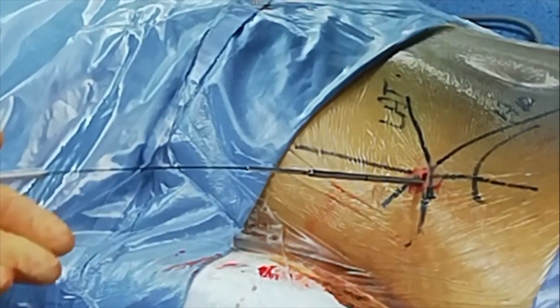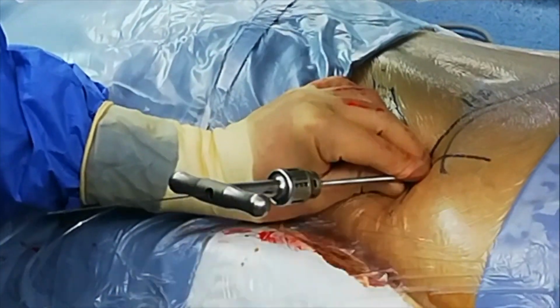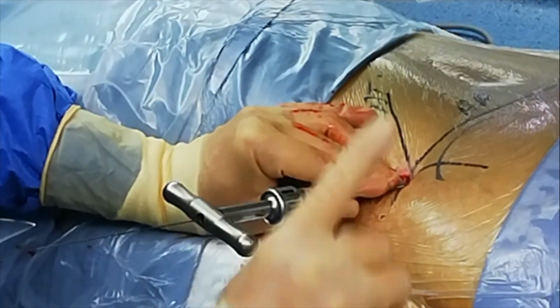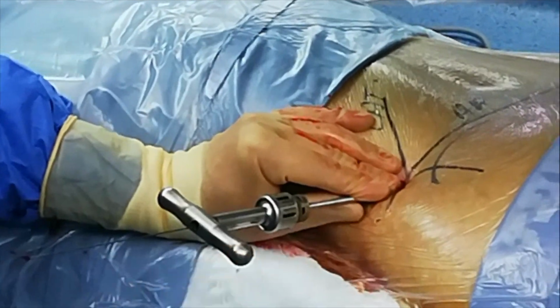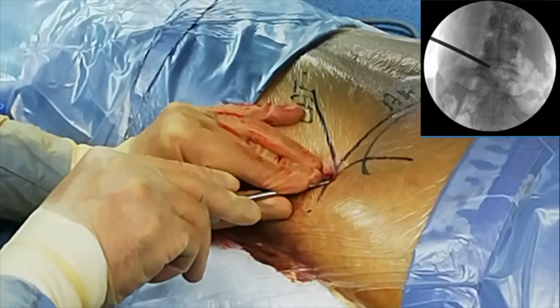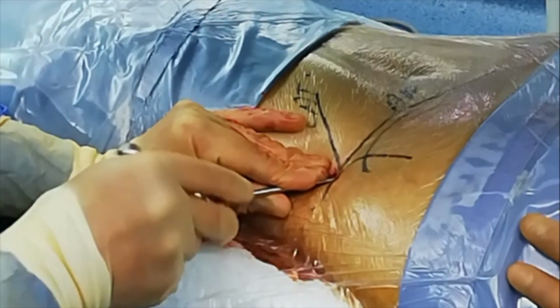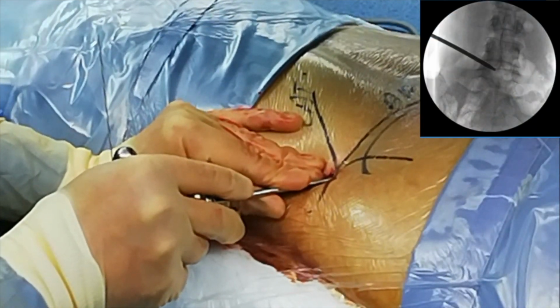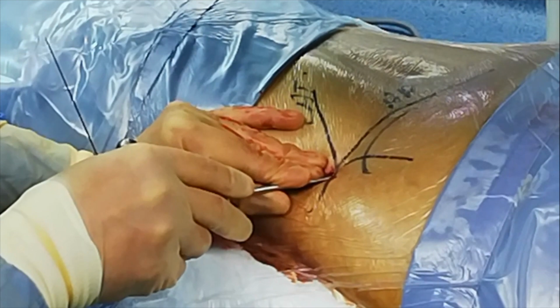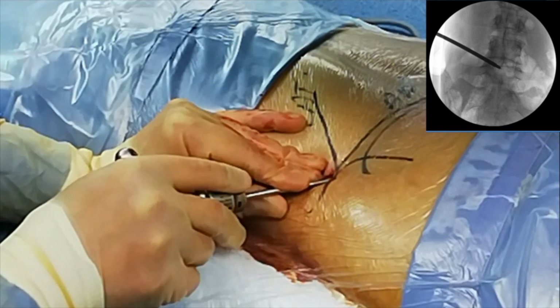So the way we insert the reamers, anti-clockwise as we go in, you hit the bone, and then you need to press down so that you ream the SAP ventrally. So we need to go dorsal. This is why you drop your hand. Reaming is on the AP, remember that. X-ray please. So I'm reaming to reach the medial border of the pedicle on my side. X-ray. Okay, and that should be okay.